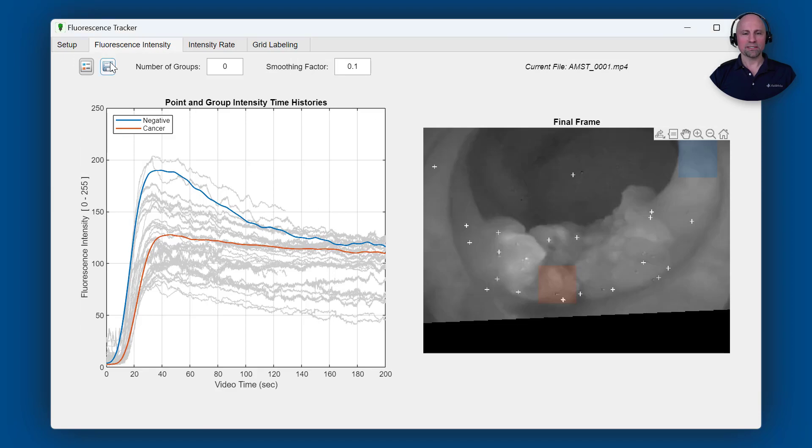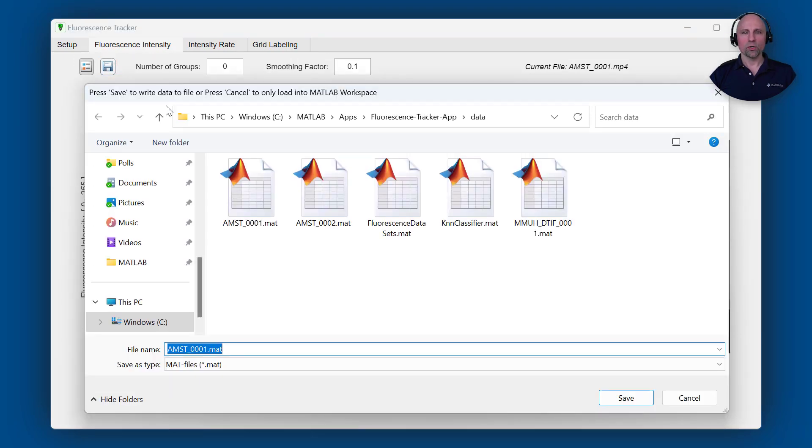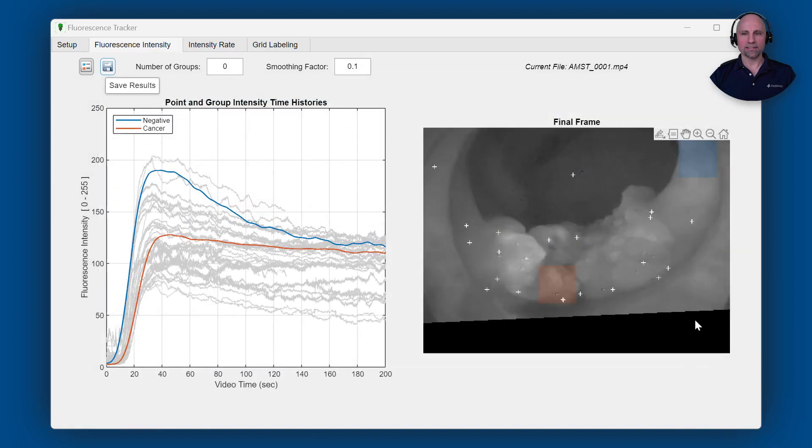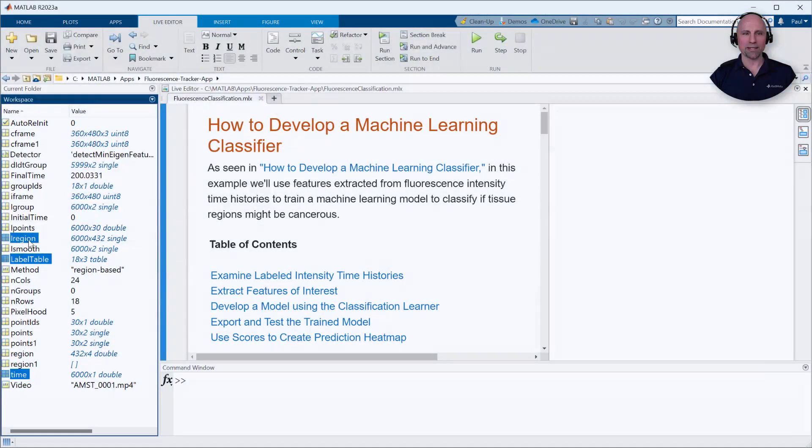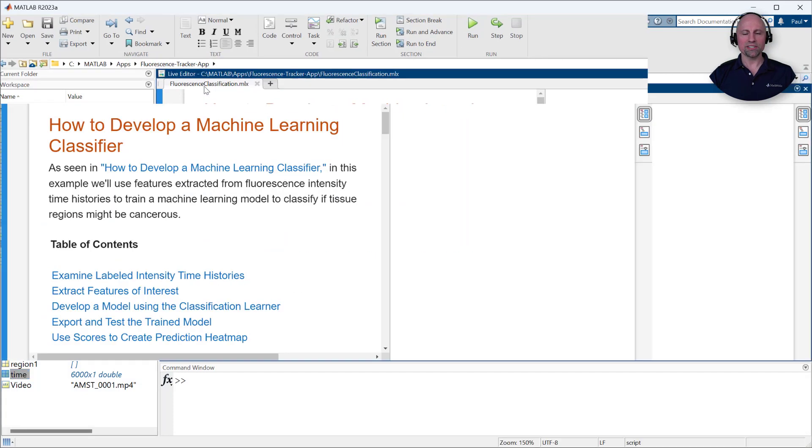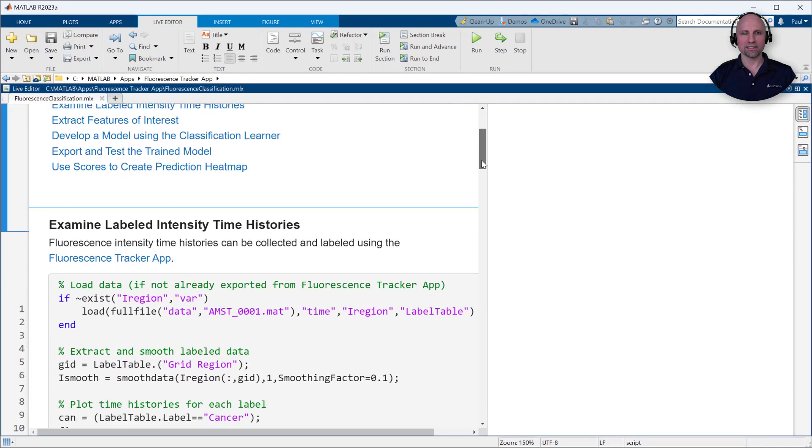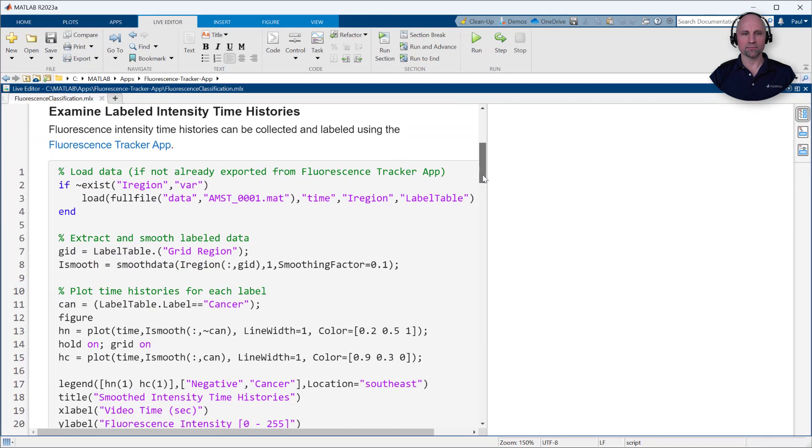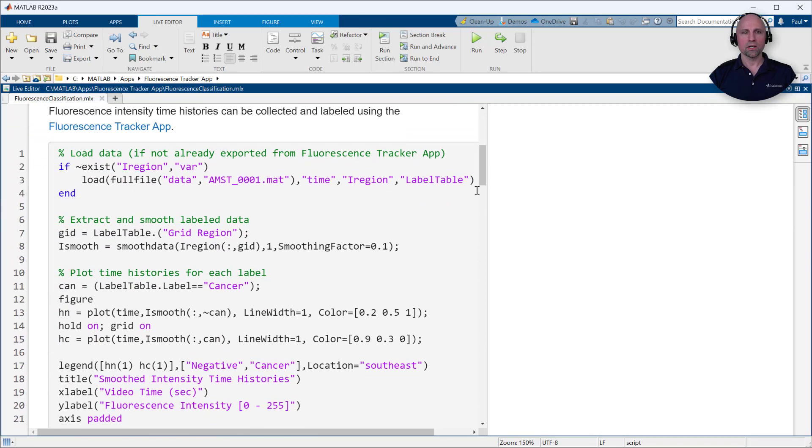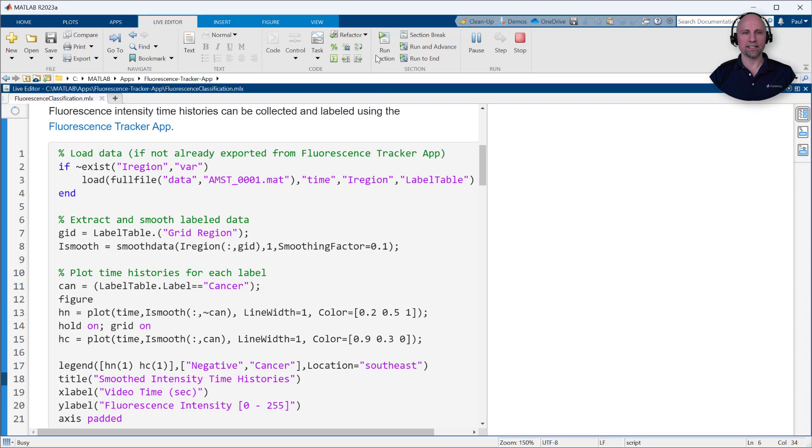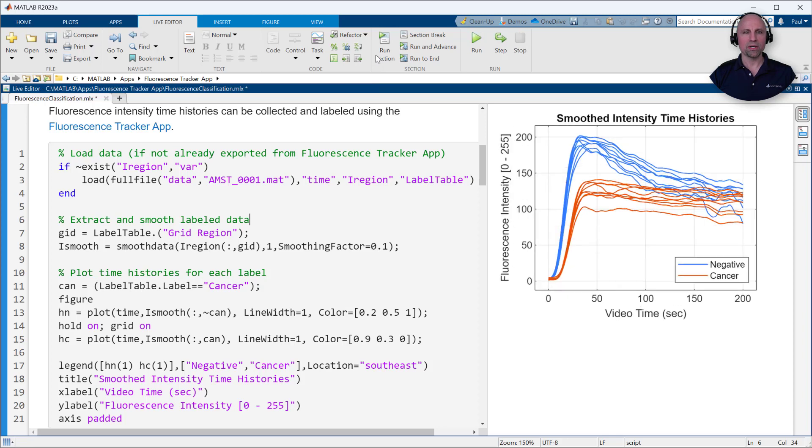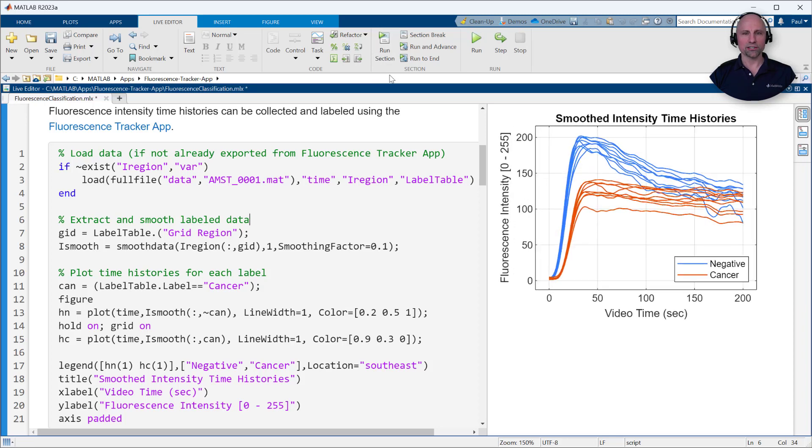Once processing completes, we can use the save button to export the intensity time histories and region labels to the MATLAB workspace. We can then use the region labels to quickly visualize potential differences in their intensity time histories. The UCD research team has observed statistically significant differences in features related to the intensity ramp up and decay signatures.